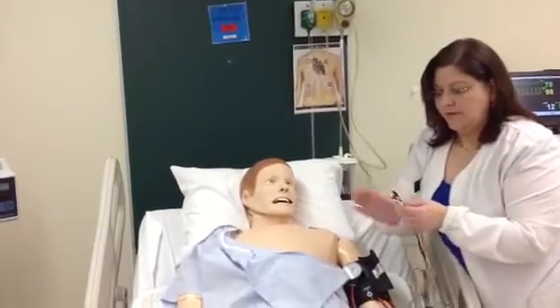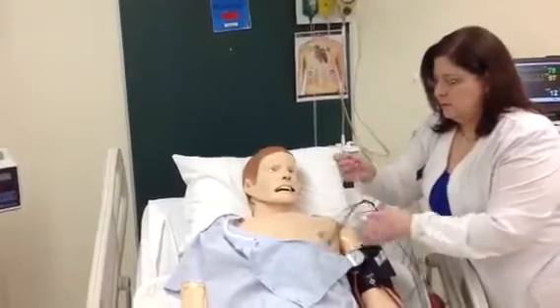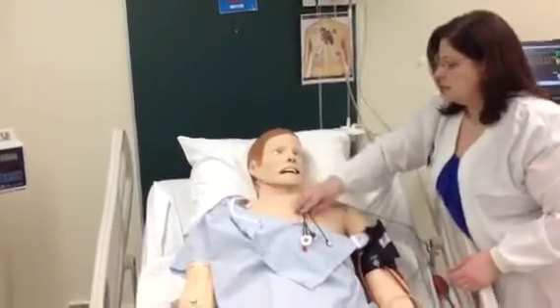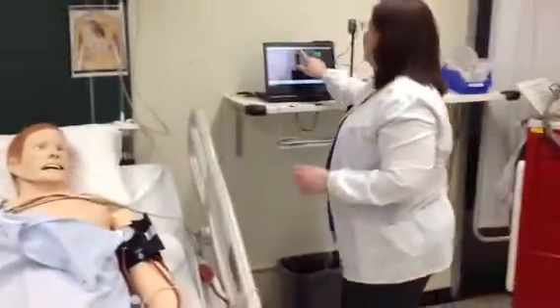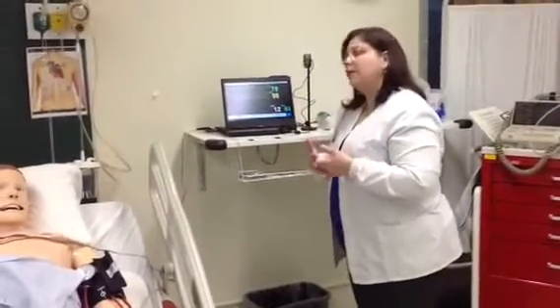I'm not going to put all 5 on. Take this off. Stick it onto the chest. Stick all the rest of them onto the chest. All of the stickers on, and then you'll be able to touch that, and it will give you a heart rate, and it will give you the rhythm.